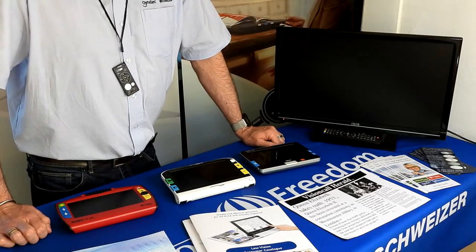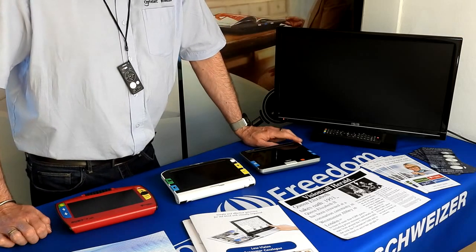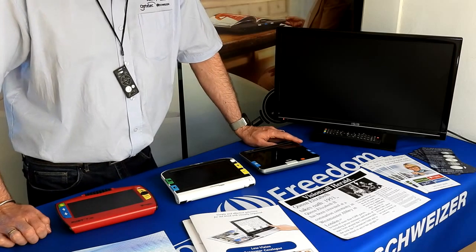Hello, my name is Paul, I'm from Optelec Enhanced Vision. Welcome to another video. Today I have the pleasure of showing you our 7-inch portable video magnifier range.